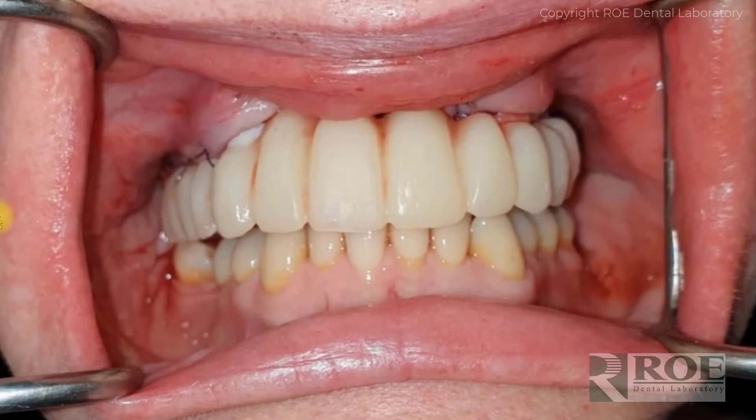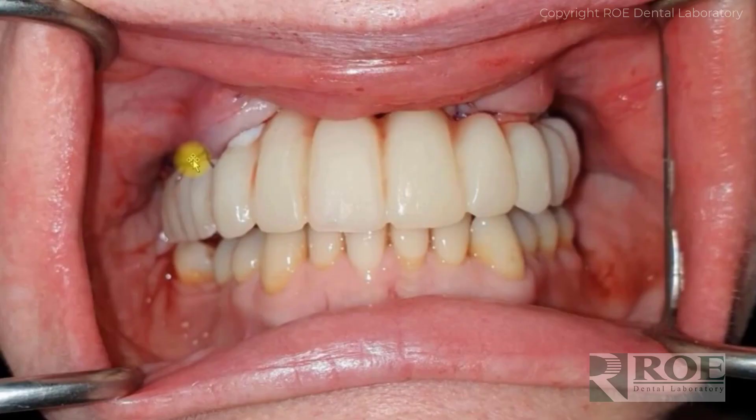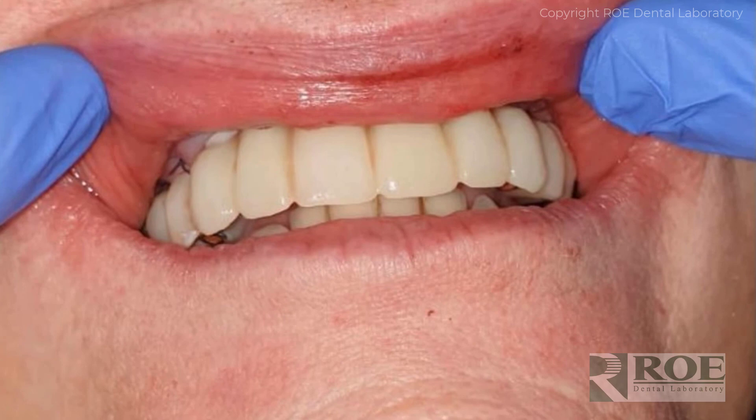The patient will pull their lips up and look, and this case turned out really, really nice. It's important to set the expectation that this is not a glamorous surgery at least at the junction of the prosthetic and the tissue — there will be sutures, some bleeding, and some gaps. Hopefully this is the smile they focus on, and it will look better as healing happens and as we transition to a final restoration. That is the process for a Chrome Natural case, and I hope these tips help any doctor performing this procedure.